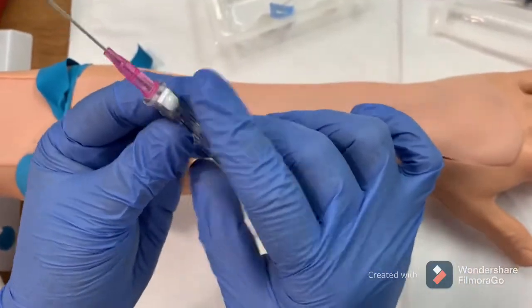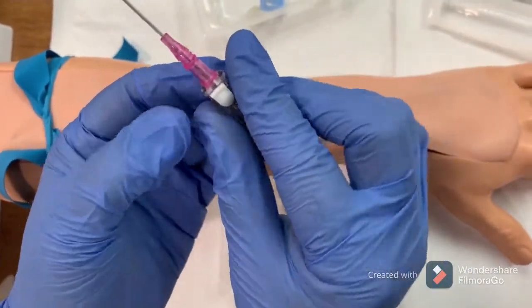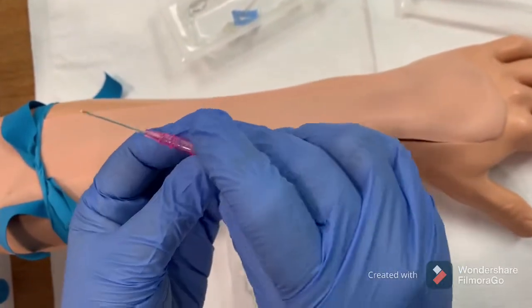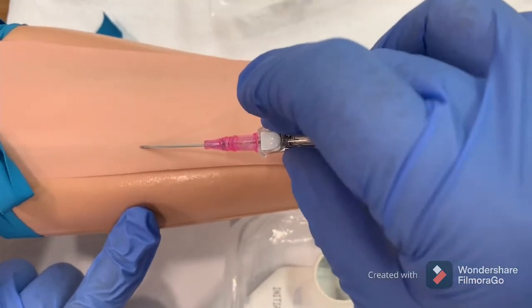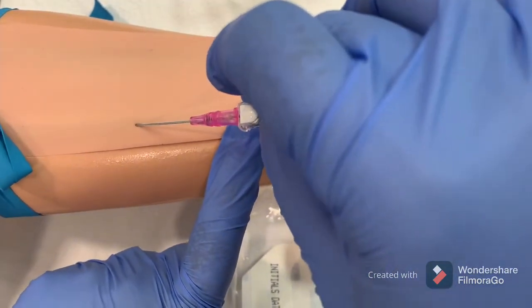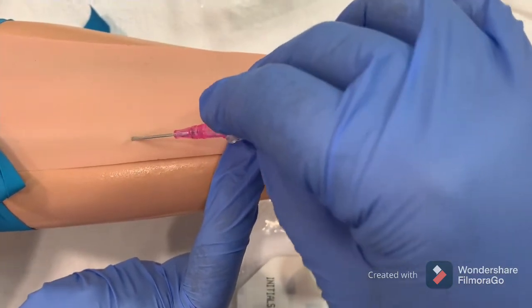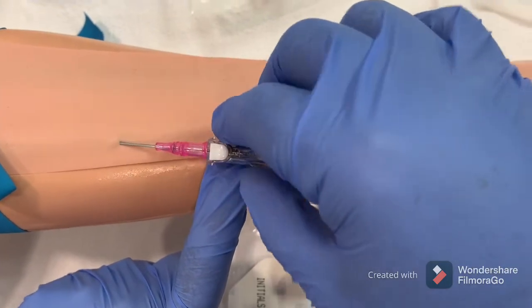Get the catheter, remove the cap, and hold it between the thumb and middle finger. The index finger should always be free in order to manipulate the needle. Always keep a 15-degree angle for insertion.